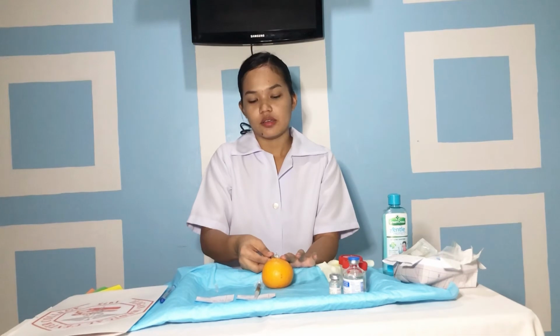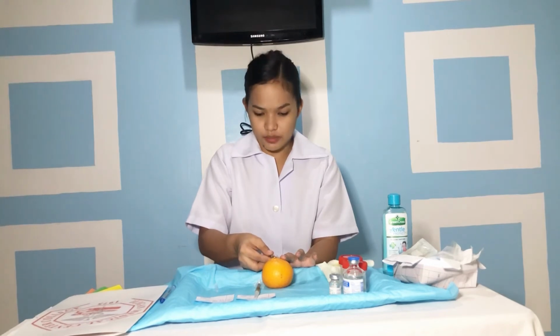So we inject the medication slowly. Normally, we can feel resistance. So if not, then the needle is too deep. So remove it and begin again. So slow injection minimizes discomfort at the site.